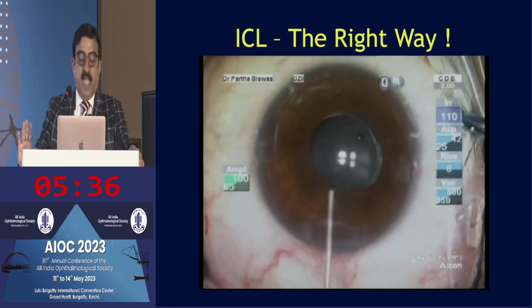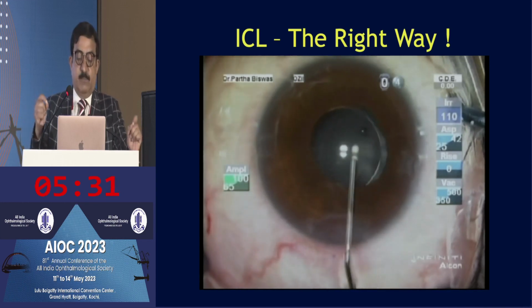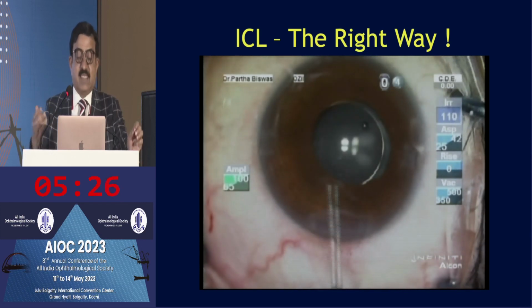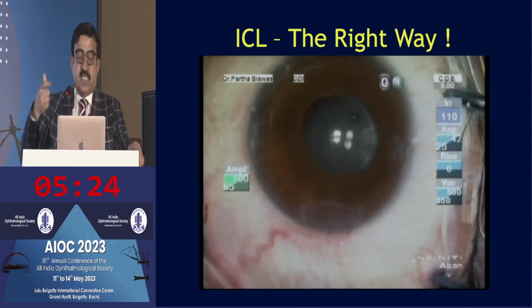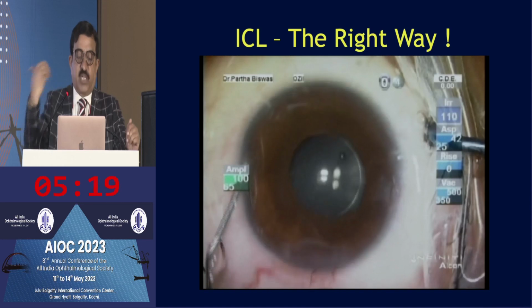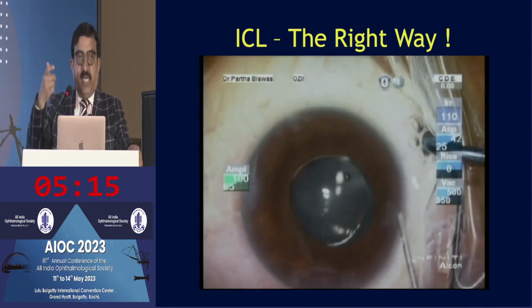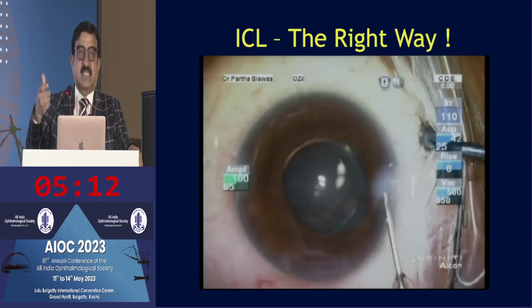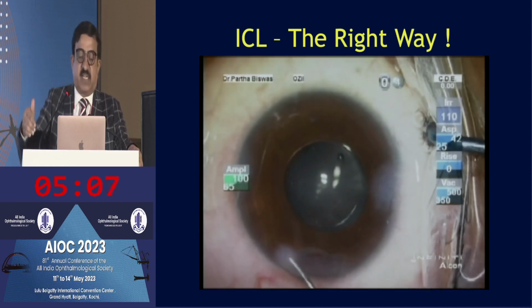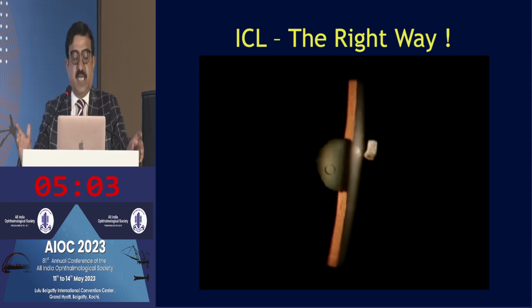manipulations at all, and then the viscoelastic needs to be washed out. Now, washing out the viscoelastic as much as possible is important. The Healon can come out in one go. The methyl cellulose needs to be taken up. At one time, it was thought that the central hole, which can flush out the methyl cellulose, could be used very simply, but it is best not to jet on that central hole, because it has been found that cataractous changes might take place if there's a jet going down for a very long time. So it's very simple, that's it, and good closure.